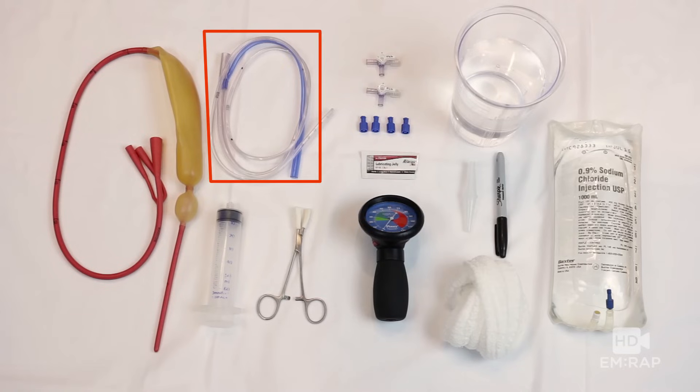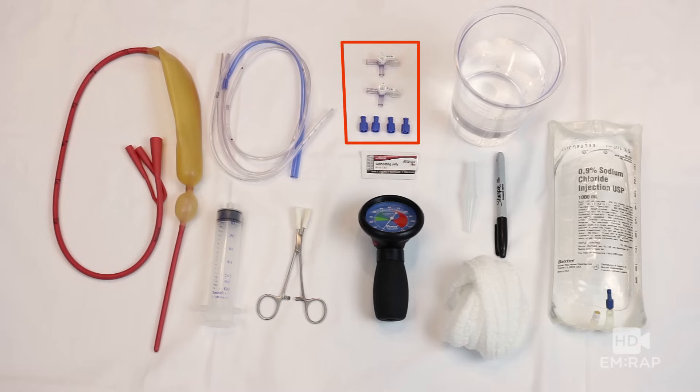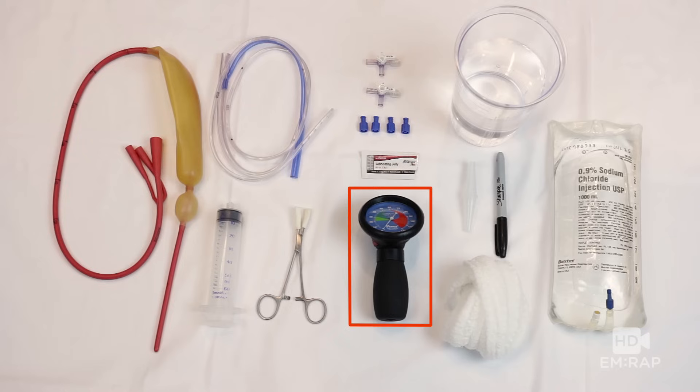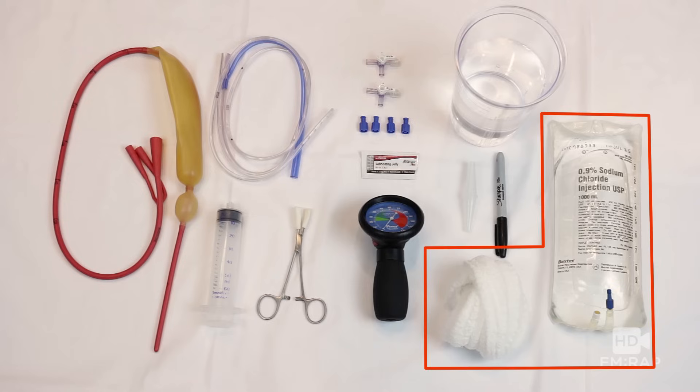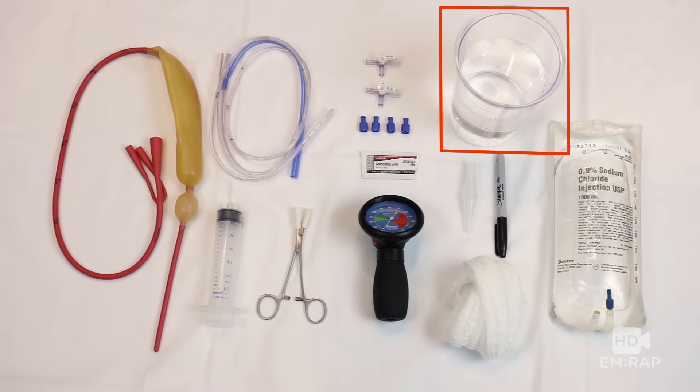You also need an OG tube, a 50cc syringe, kelly clamps with tape on the edges, two three-way stopcocks, four dual luer lock caps, lubricating jelly, a manometer — I recommend the Posey Cufflater because it fits onto the three-way stopcock, it insufflates, and your respiratory therapist has one, just call RT. A Christmas tree, a Sharpie pen, a traction device, and we're going to use Curlix, a liter bag of saline, and a bucket of water.